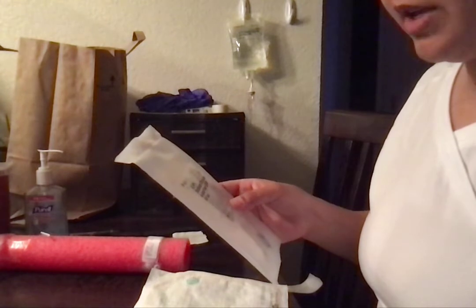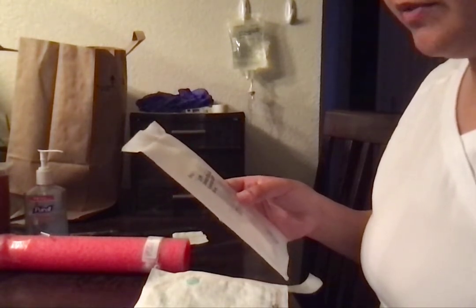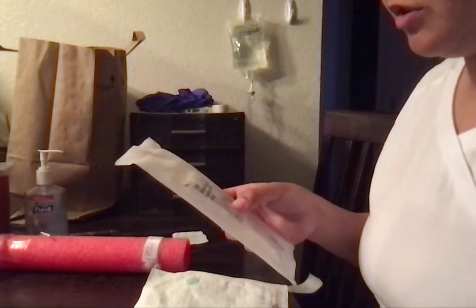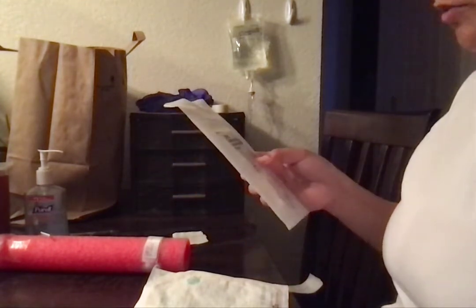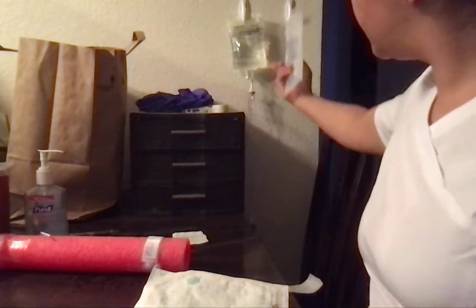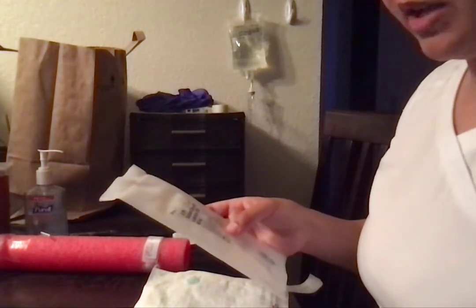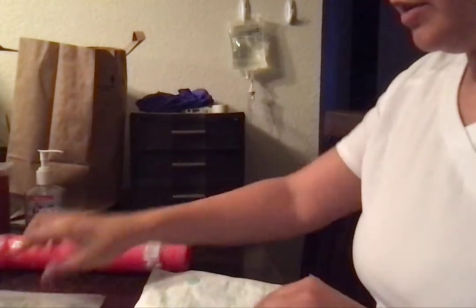So we are giving ciprofloxacin 200 milligrams in a 50 milliliter bag. That's correct. It's mixed with 0.9% sodium chloride. That's right. And we're hanging it off of normal saline, 0.9. Perfect. So that all goes together. I already did the math. We're going to be giving it at 25 drops per minute. Okay, everything looks good there.